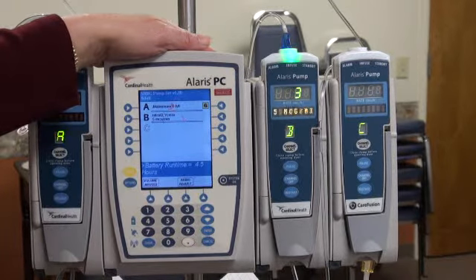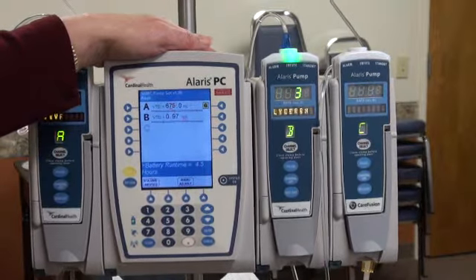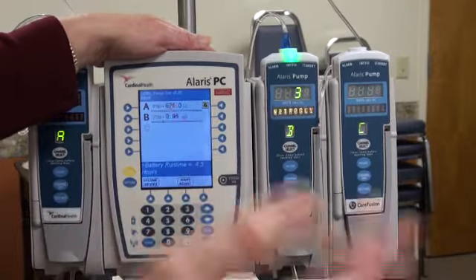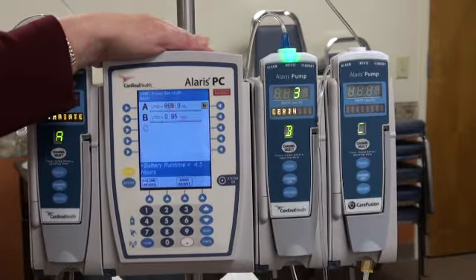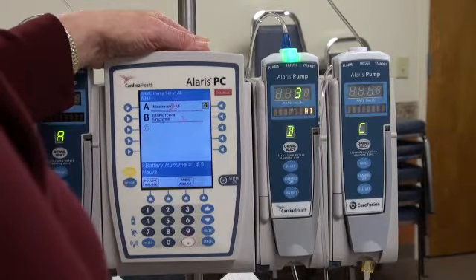So you're taking a patient down the road. You were told the patient's on 5 mics a minute of nitroglycerin, and they're to remain on that, say, unless their pain increases. So the patient started out, chest pain was a 2 when you were at the ambulatory care. You get to Columbus Grove and he starts with pain. He says it's increased to a 6.